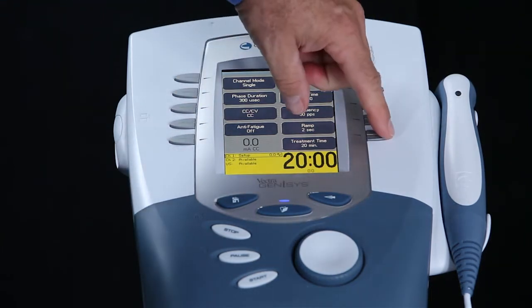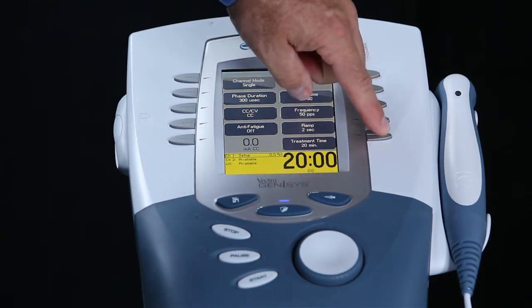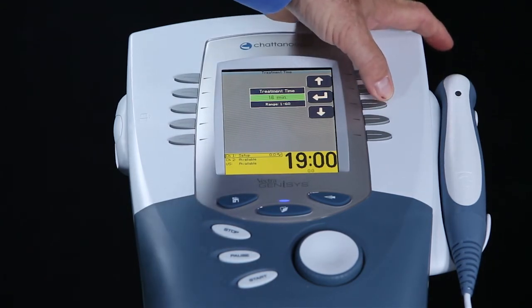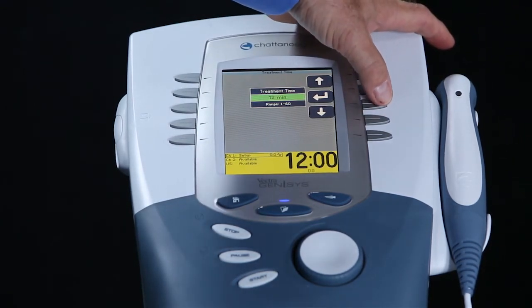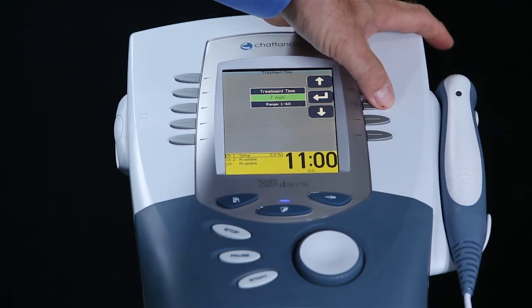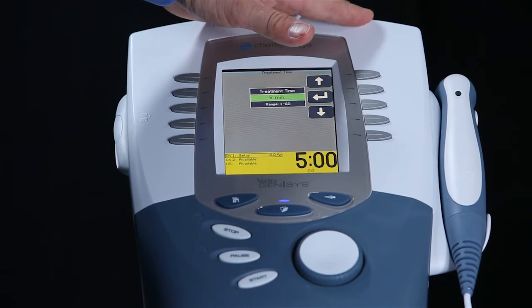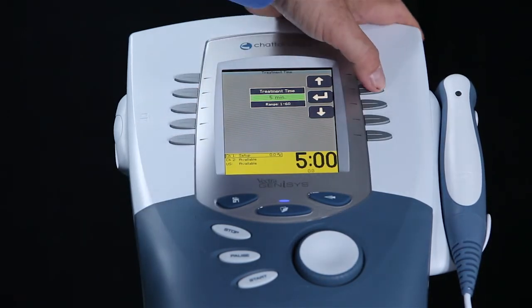The last adjustable parameter is treatment time. We want to reduce the treatment time to 5 minutes. Initially, we want short treatment times because of the fatigue the patient will experience. As time goes on, we will increase the length of the treatment time so that we can get in more contractions and build up the endurance of the patient.